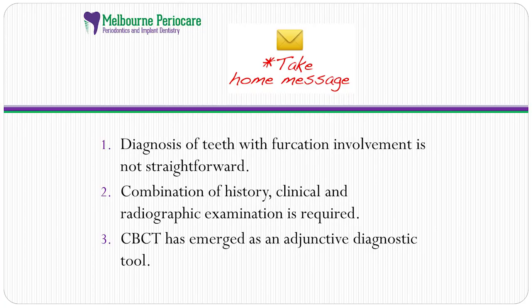So what's the take-home message today? Do we need CBCT in every case to detect furcation involvement? Well, the simple answer is no. Diagnosis of teeth with furcation involvement is not straightforward. A combination of history, clinical, and radiographic examination is required to come to any conclusion of furcation involvement. And CBCT in recent years has emerged as a strong adjunctive diagnostic tool to detect furcation involvement.